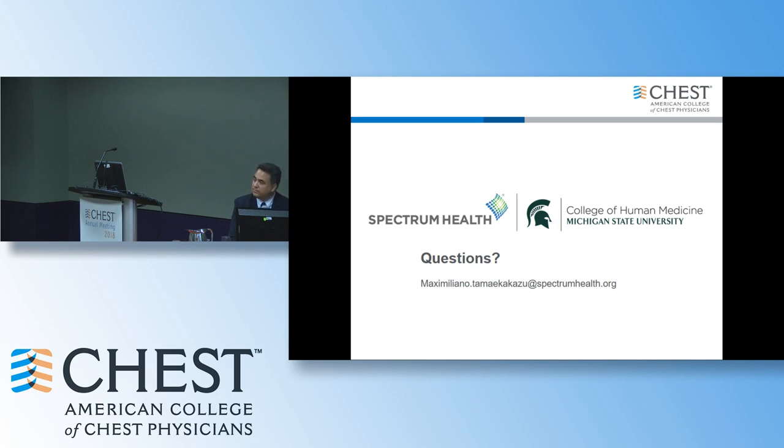When you take these measurements, do you use short-term neuromuscular blockade to get accurate pressure, or just to prevent strain? Well, usually when we try the esophageal balloon, the patient is already paralyzed. Most of the time. And that helps you. But you could use deep sedation, and you can look at the esophageal pressure to see if the patient is doing any effort as well. But yes, if you use paralytics, that would give you a more accurate measurement. We both glazed over that fact, but in most of these studies, the patients are very heavily sedated or paralyzed. You can calculate the amount of work of breathing and the triggering that the patient's doing if you wanted to. But for ARDS, most of the time, they're paralyzed or at least deeply sedated.